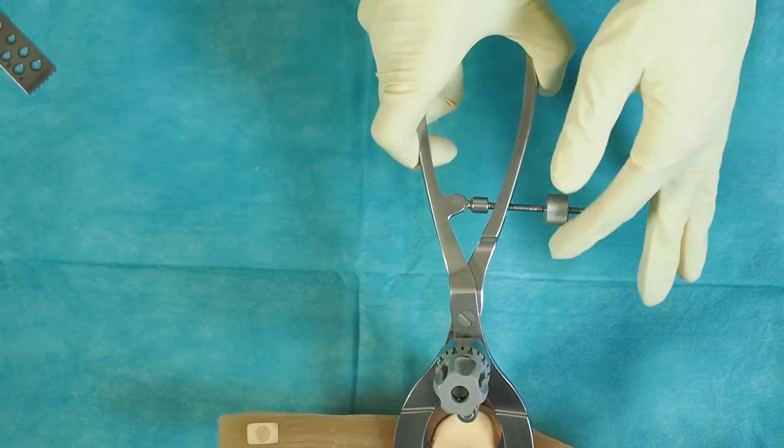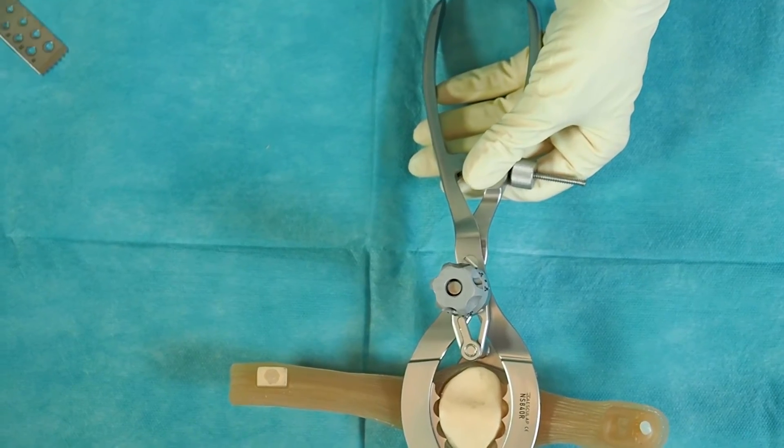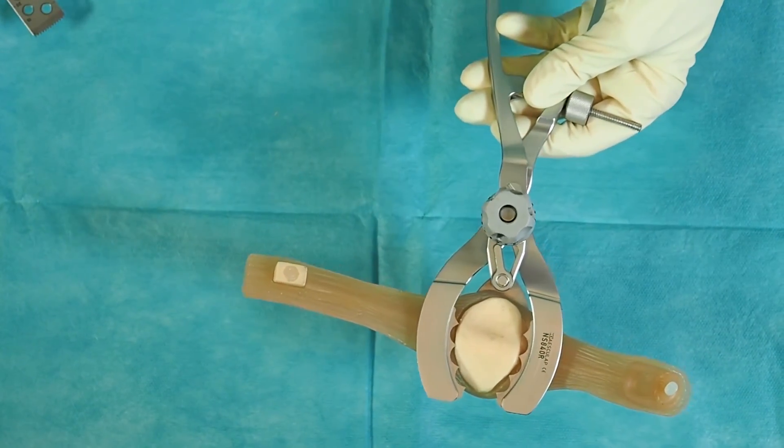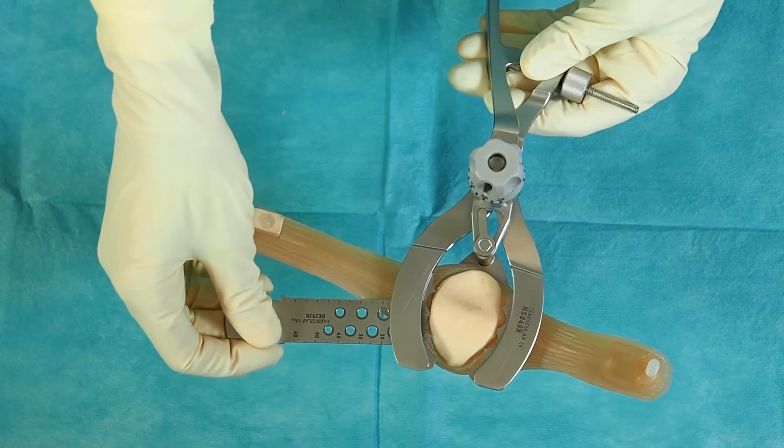By turning the screw, the position of the patella resection clamp is fixed. With a 1.27 mm thick saw blade, the resection is performed through the cutting slot.